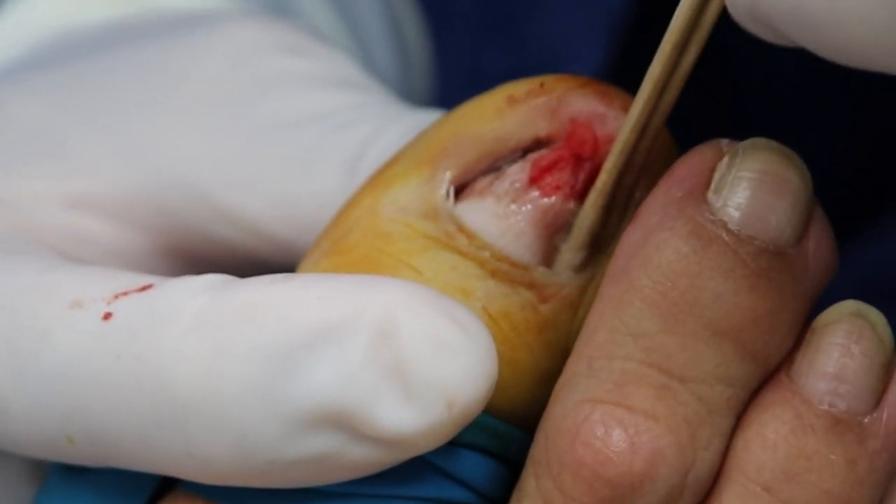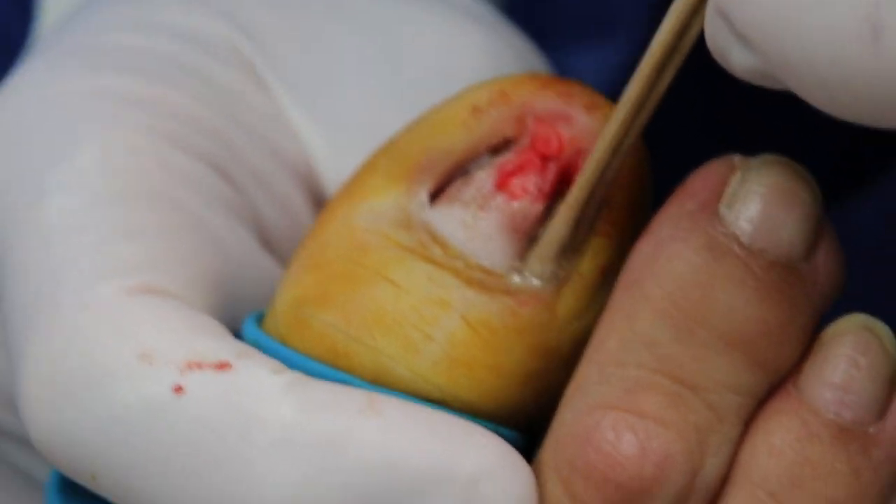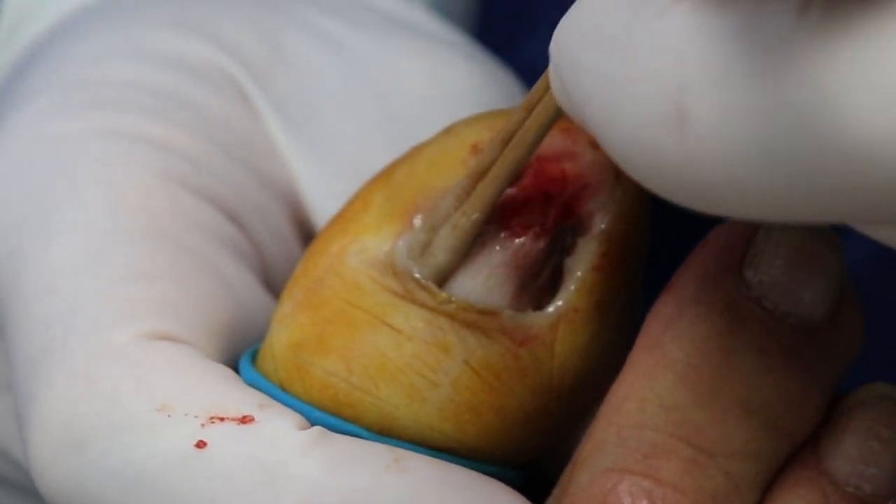I think on the left side there is something sticking under. It was very curved - it's gone now. You're going to find your YouTube video and you're going to see how bad it was. So we're just going to apply the acid and this is what's going to stop it. What did you do so that it may not grow anymore? The acid. We're going to put this acid all over where the nail grows from - we're basically chemically burning the nail cells, cauterizing them with chemical. Do you feel anything? No. Relax your foot. There's no pain, right? No. You just sit there and look good.